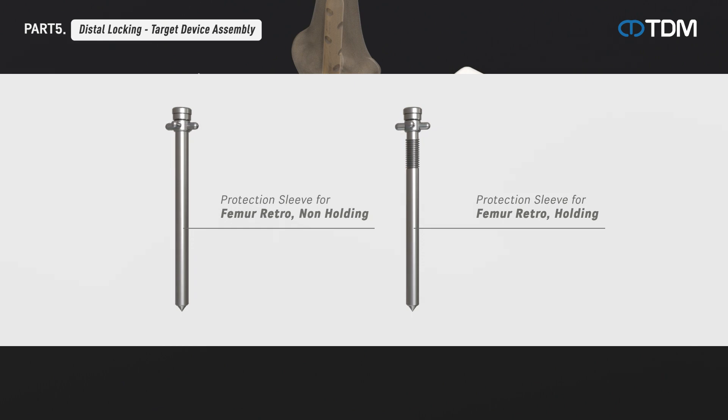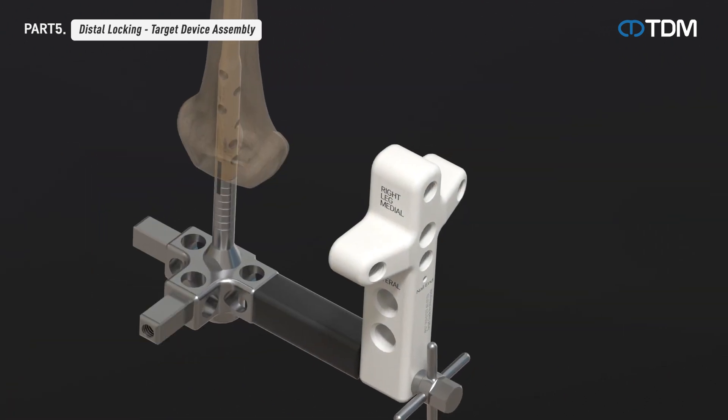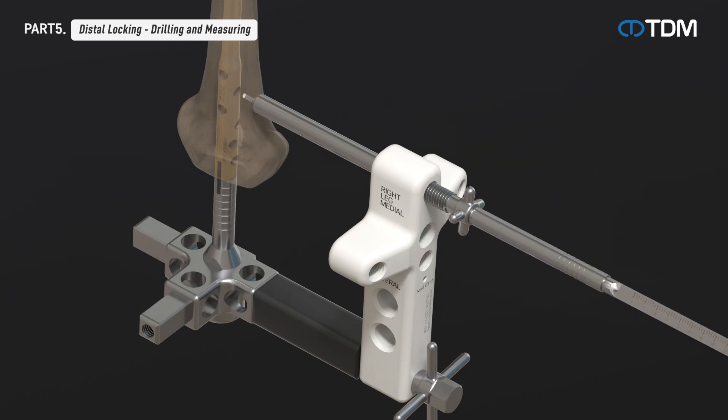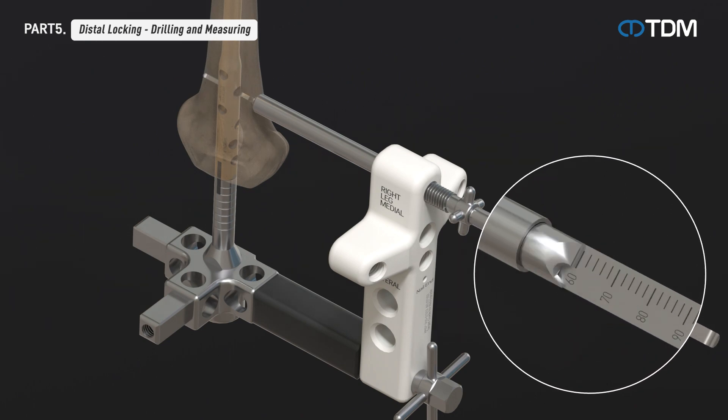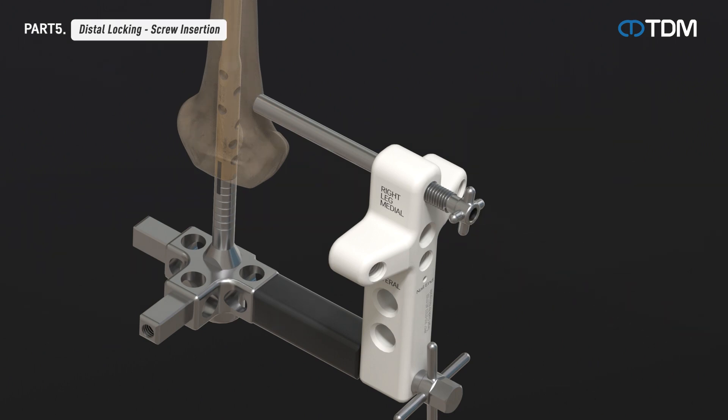There are two types of protection sleeves depending on whether there is a thread or not. Select and use them according to needs. Remove the trocar from the combination of protection sleeve, drill sleeve, and trocar, then drill until the drill bit penetrates both cortex and measure the depth with the depth gauge to determine the length of the screw. Using a screwdriver, insert the locking screw through the protection sleeve.